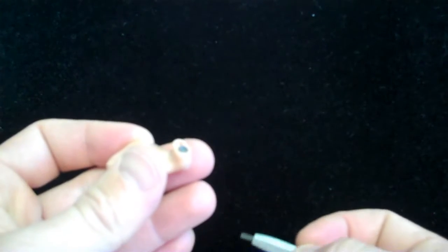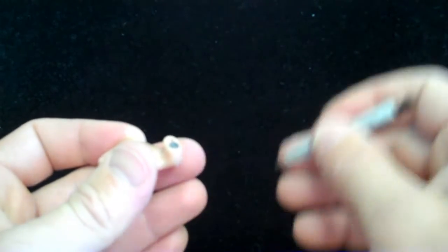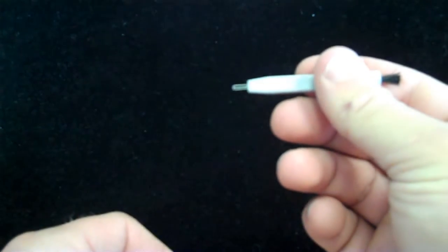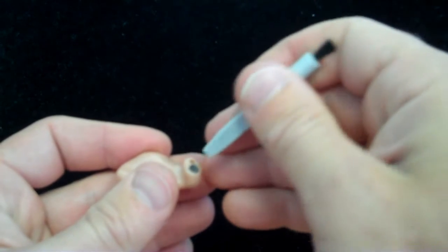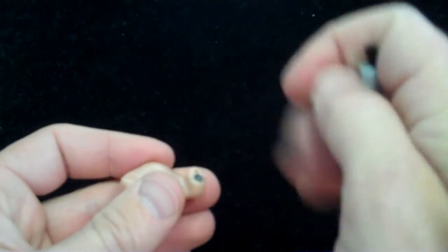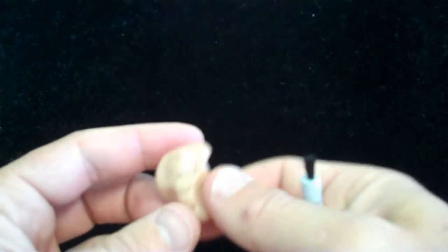But in an in-the-ear hearing aid, keep in mind, all of the electronics are within the shell here, so be a little less aggressive and very careful with regards to how deep you insert that wire loop. So maybe just half the wire loop, scoop it out just like so. You can be a little more aggressive with the air hole here. Now in another video I'll discuss how to change those wax guards on a couple of styles.